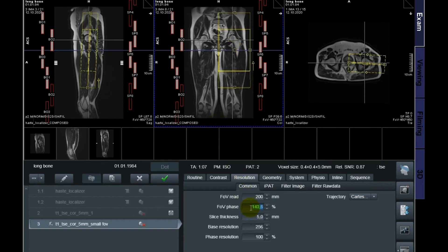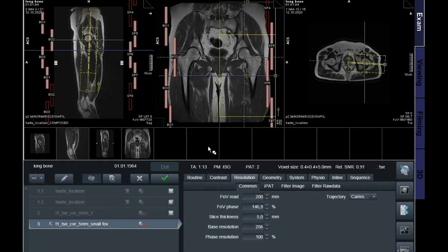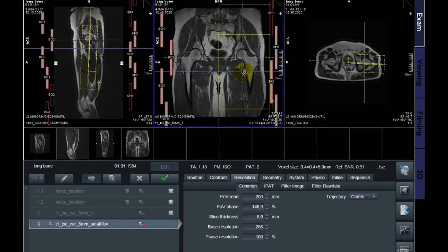I'm going to stretch this a little bit more — now we are at almost 30 centimeters of field of view, even though it says 200, because we're stretching the FOV phase. I'll position that and scan it. Look at the relative SNR — we are now at 0.91, almost the same as before. Scan time is almost the same, but we are now very dedicated to one specific area.